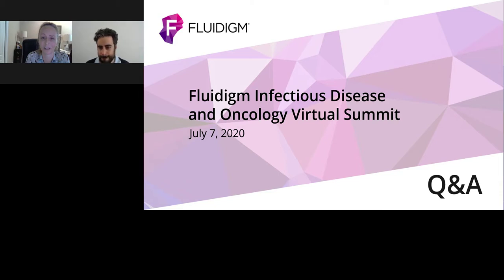Okay, thank you. Is IMC applicable to other tissue types or just for FFPE? It really shouldn't matter. So we also use imaging mass cytometry panels on snap frozen tissue. What one has to realize is that the panel of antibodies will not be the same for FFPE and for frozen tissue. And that has to do with the availability of the antigens.